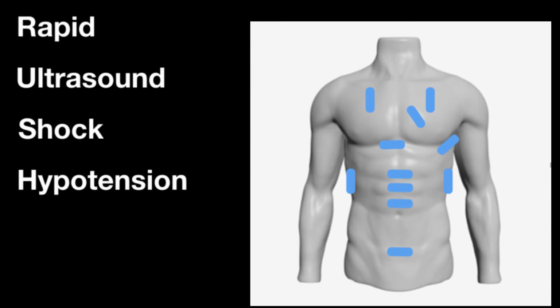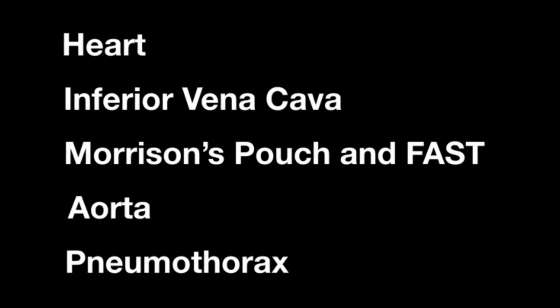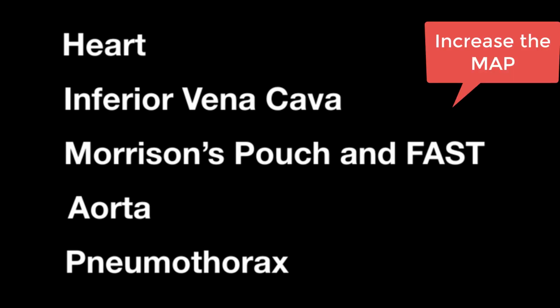So how do we know where to begin? Fortunately, people far smarter than I have come up with the mnemonic HI-MAP, and this will be our approach. Let's start with the heart.